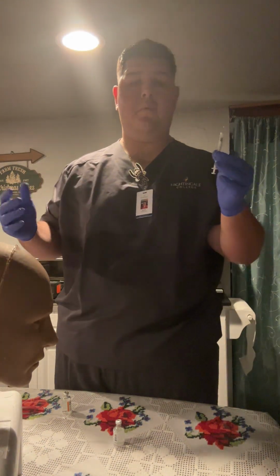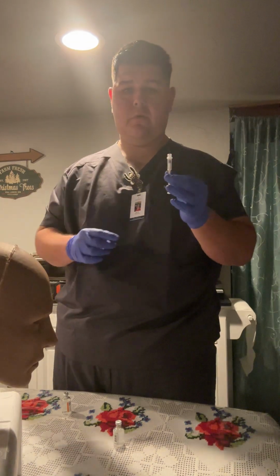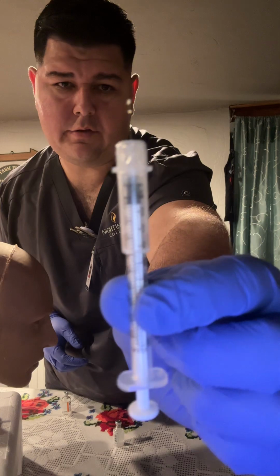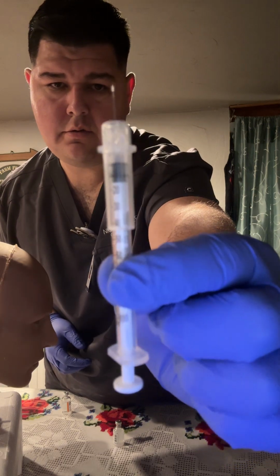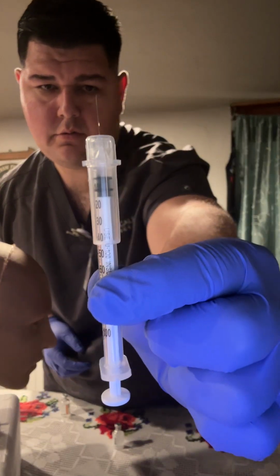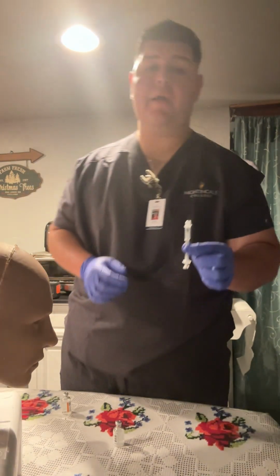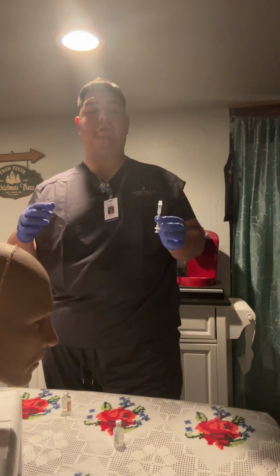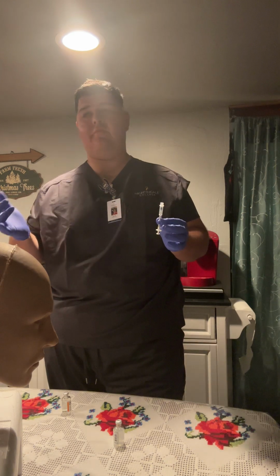Okay, the nurse and I will both verify the 4 units with the MAR. And I will show the 4 units to the camera here. Very hard to see. Now I can get the intermediate medication, but I need to ensure that I don't mix any of the regular medication into the vial.